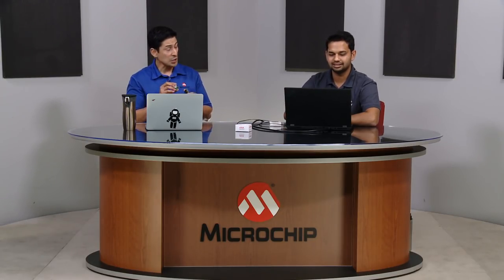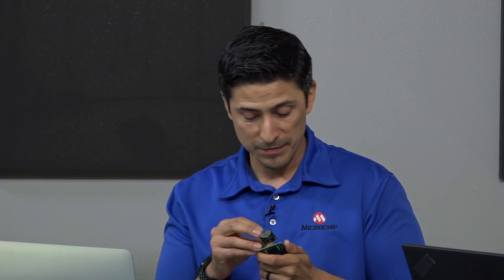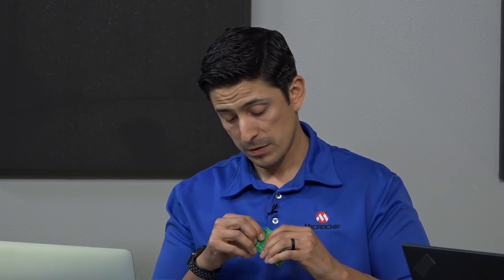While you do that, I'll plug this in. What you want to do is put it in the right direction. You want to match your grounds, the ground and VDD. Yes. Okay, you're all set right here. So you want to plug it in? Yes, please do. All right.